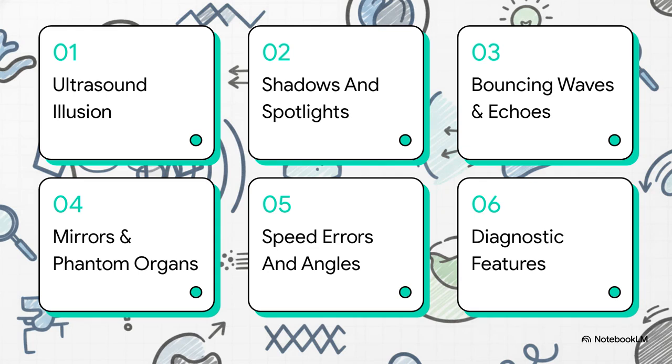Okay, let's dive into this. We've got a great roadmap for our investigation today. We're going to start with the ultrasound illusion. Then we'll look at shadows and spotlights, followed by bouncing waves and echoes. From there, we'll check out mirrors and phantom organs, speed errors and angles, and then we'll wrap the whole thing up with flaws as diagnostic features.